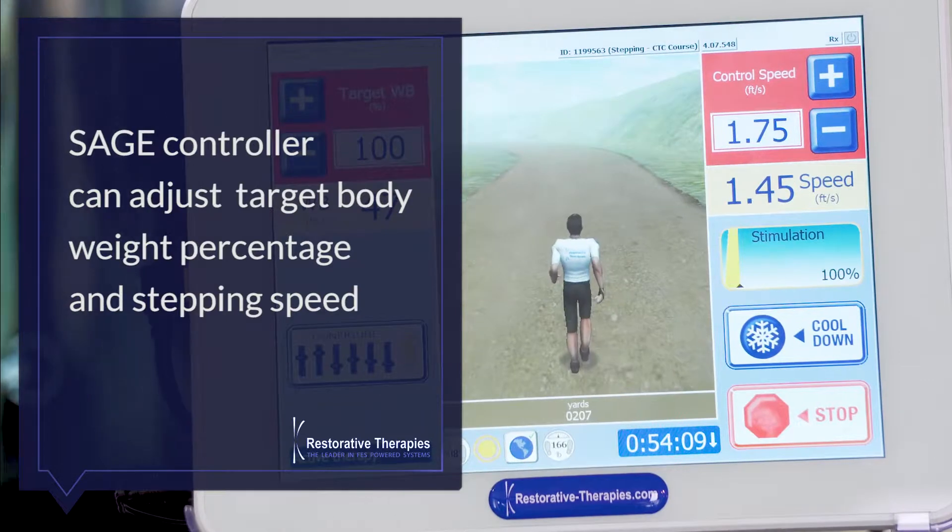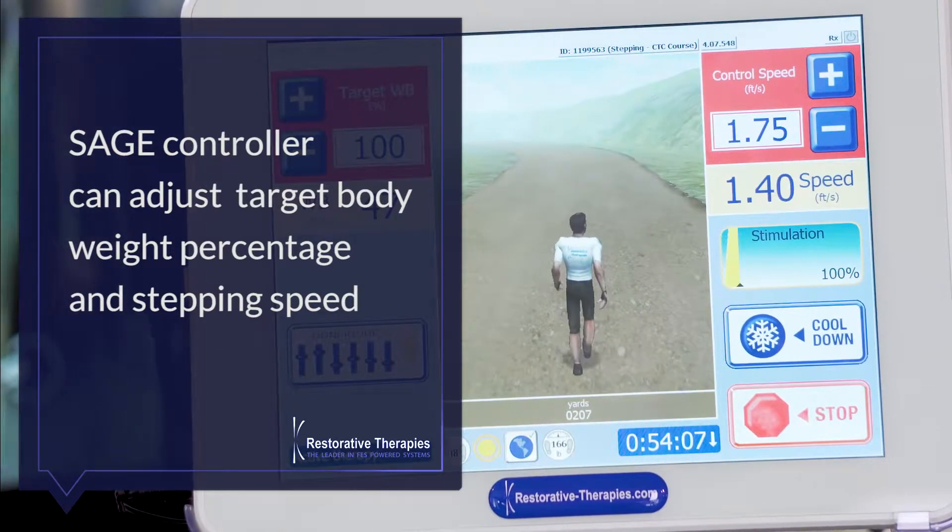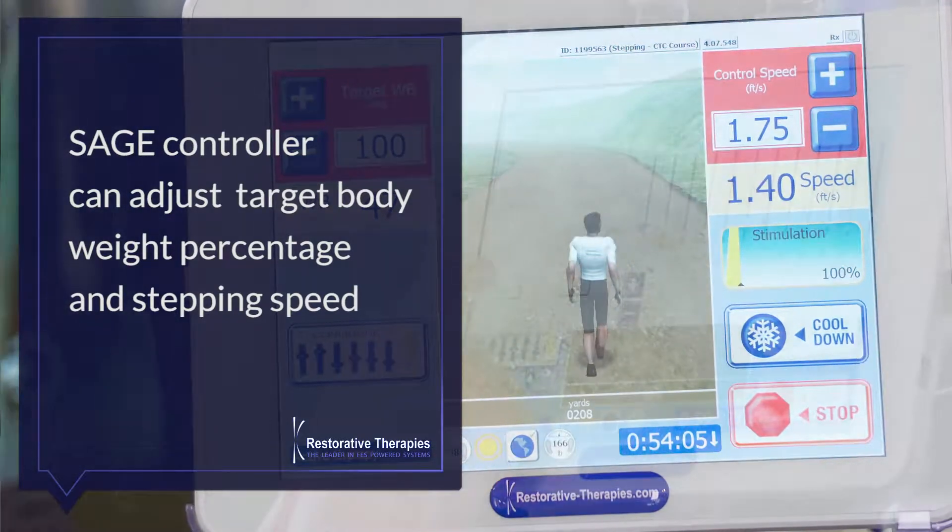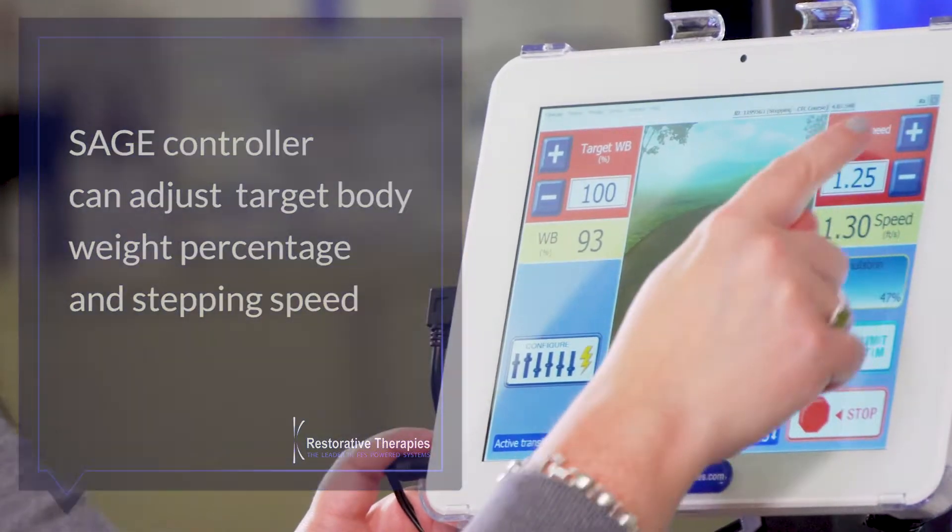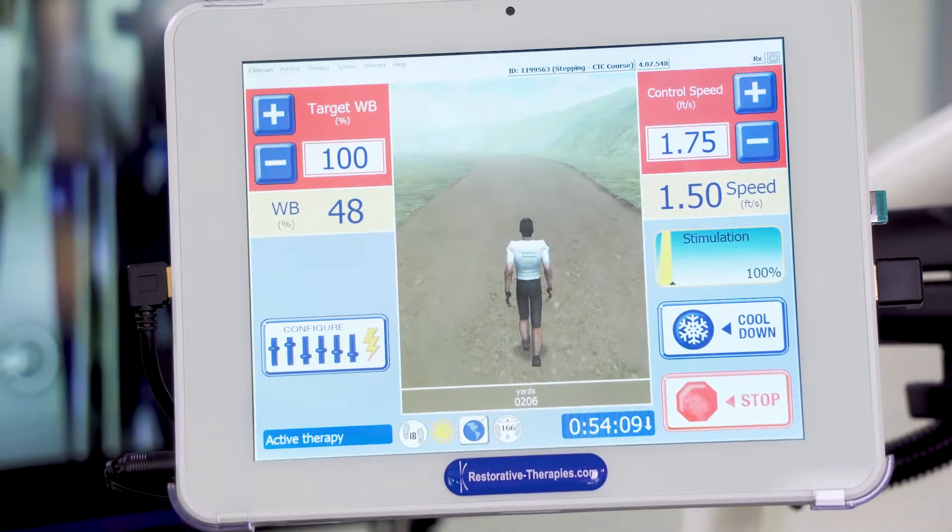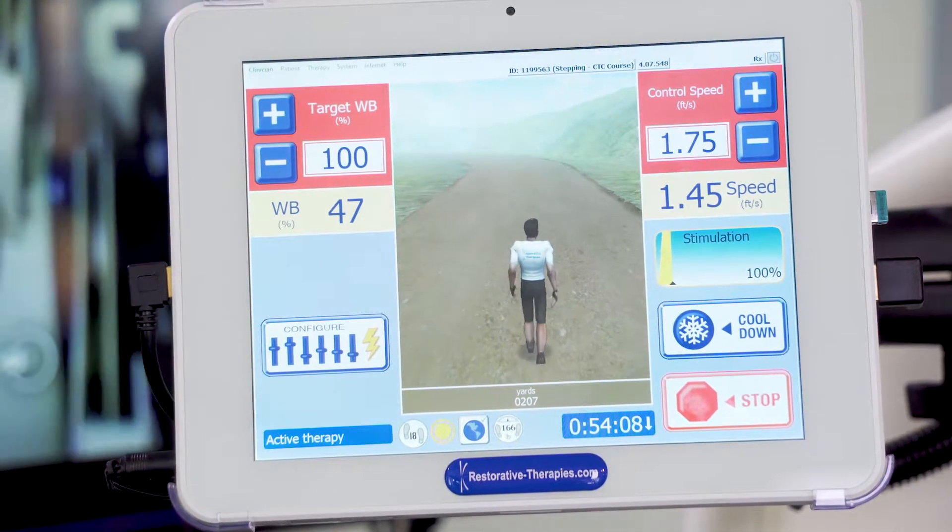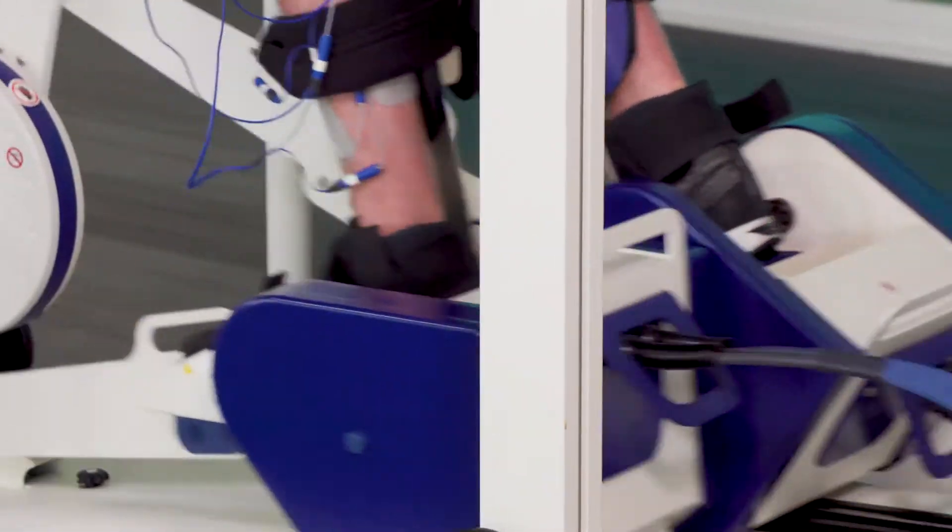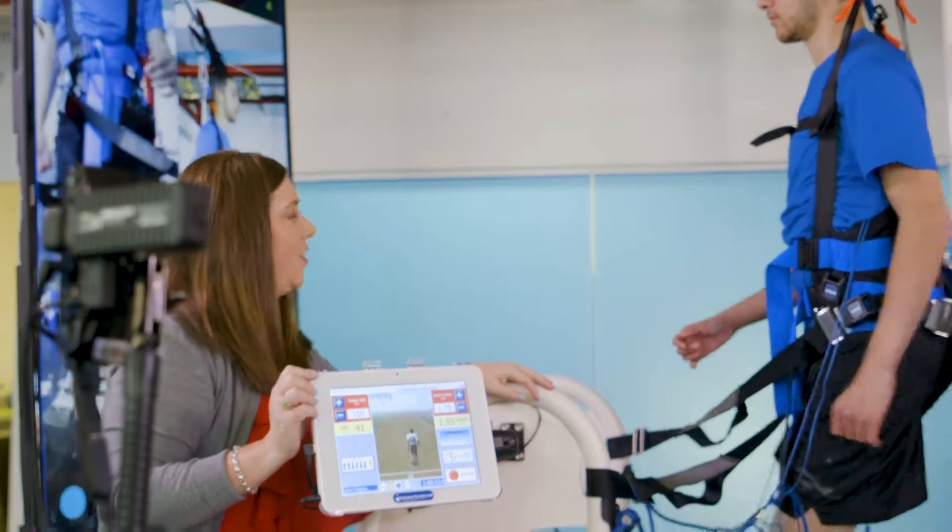Here on the RT600 Sage Controller, I can adjust Parker's target body weight percentage and his stepping speed. The RT600 Sage Controller automatically regulates the FES to help Parker's muscles bear a challenging yet appropriate percentage of his body weight while he steps.